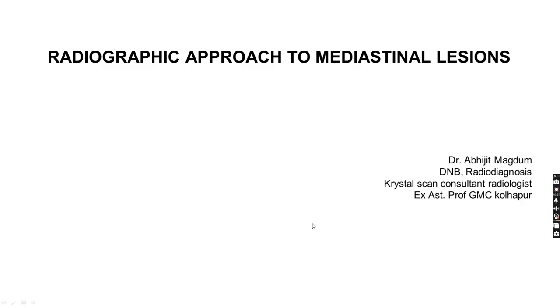Why is it important? Because it is the most common long case asked in a final radiology exam. And the second, in day-to-day practice, we have to pick up the mediastinal lesion, to detect and to diagnose it in a fast and quick way, and to send the patient to the CT.